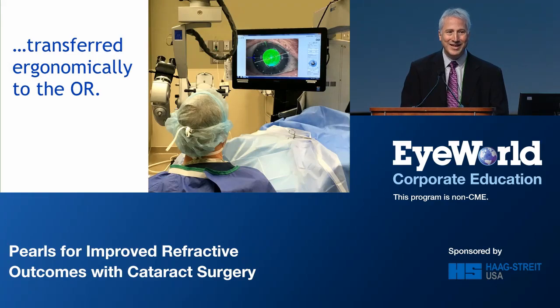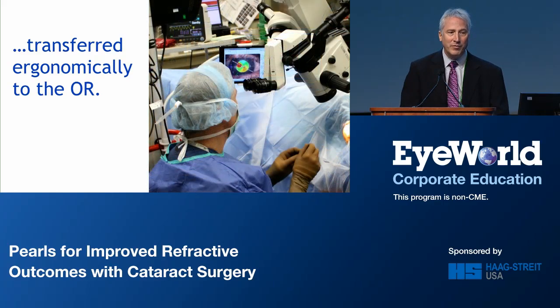And this information can now be transferred ergonomically directly to the operating room. This is my operating room, and you see the beautiful Haag-Streit microscope there, which has the platform on it that I can run the Lenstar software directly on and get a great view where I can just glance up at that screen and have the beautiful picture that I can align my toric alignment with, right? So that's great.